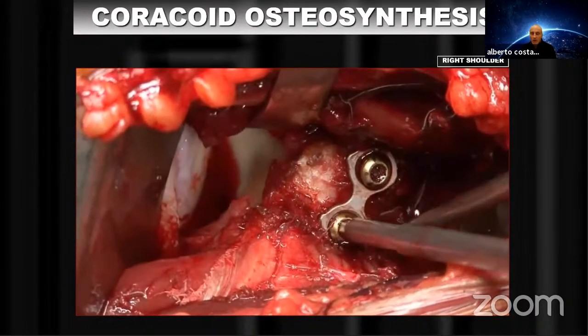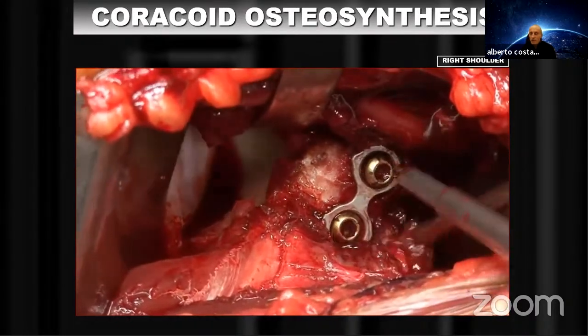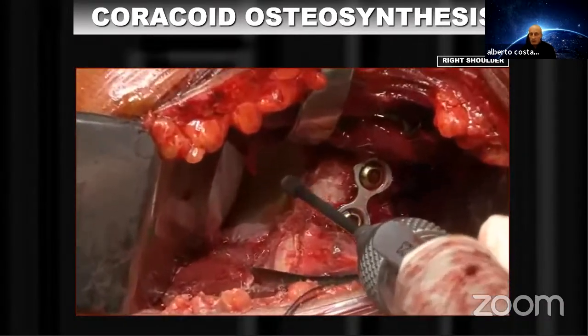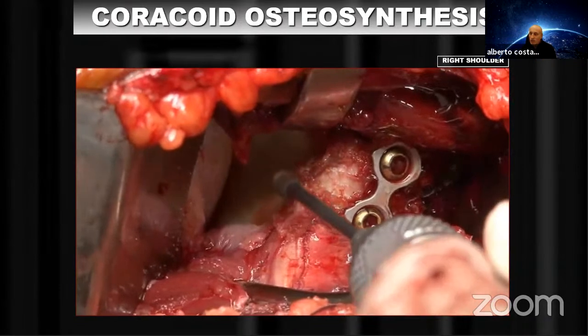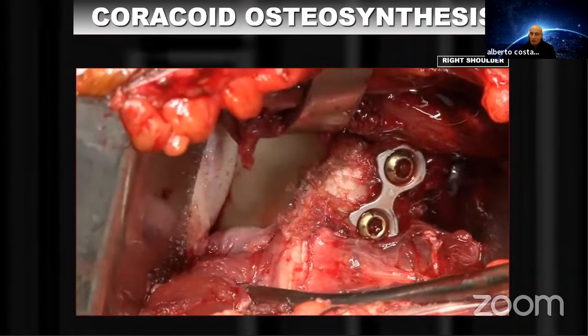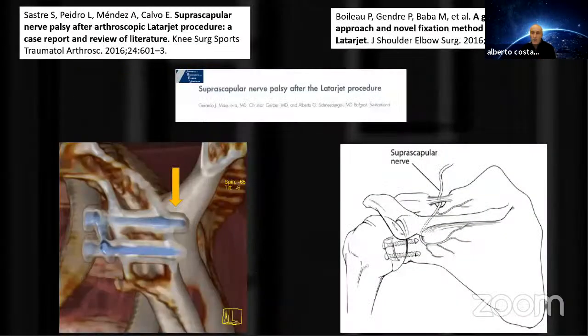Now I will show you what happens if your graft is too proud. It is not in line with the surface, so it's not flush. You can revise, and you can use this little bur to make the surface smoother, as flush and in line as you want.